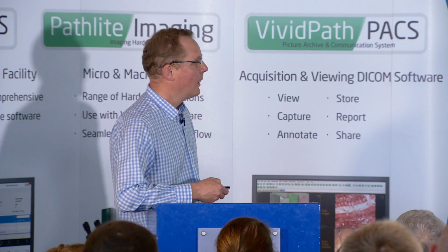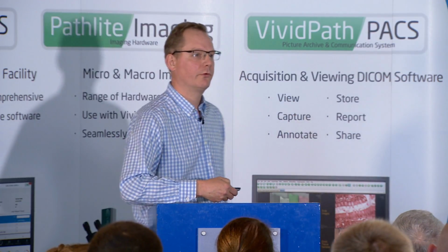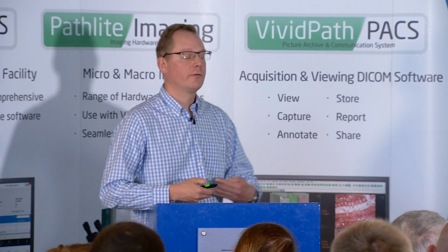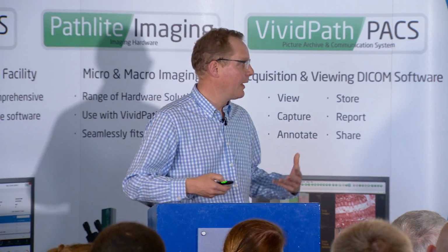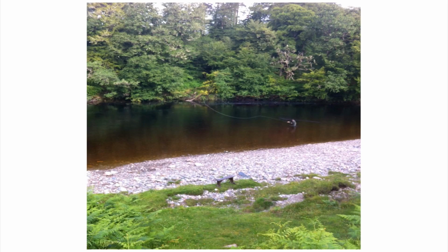So, for example, the upstream algorithms, the stuff which is done before the pathologist looks, really involves taking data straight from scanners, outputting onto servers, and looking through masses of data on whole slide images to find events of interest to then flag up for the pathologist to look at when he gets a slide to look at. So this will be off the workstation, on the cloud, computing.